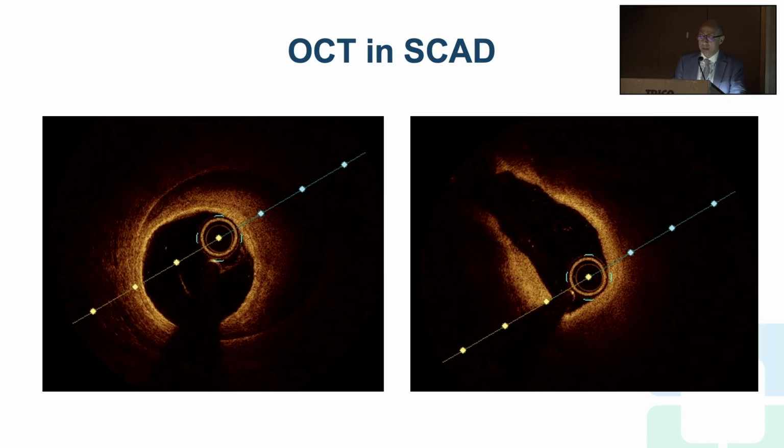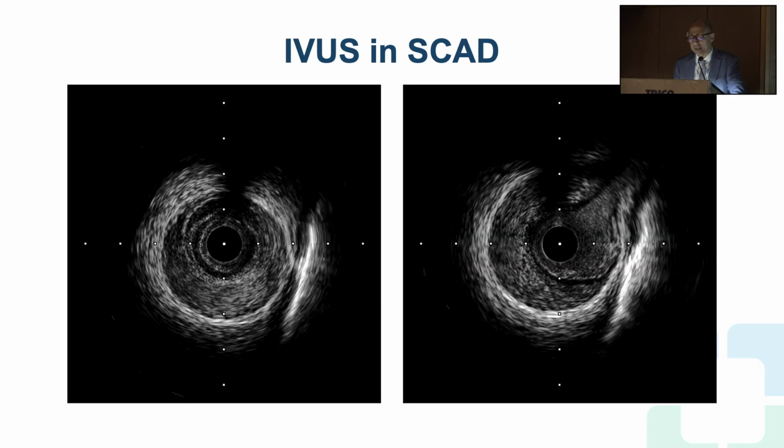that impressive. But the OCT imaging here shows clearly that there is a significant intramural hematoma of the wall with the catheter and the lumen sort of separated from the external elastic lamina. And you see that the branch point here is coming from the true lumen, which is why the artery and its branches looked all open. This is how it looks on IVUS, very similar intramural hematomas, compressing the lumen, and that's what causes the tapering. This IVUS was not from the same patient, although it looks very similar.